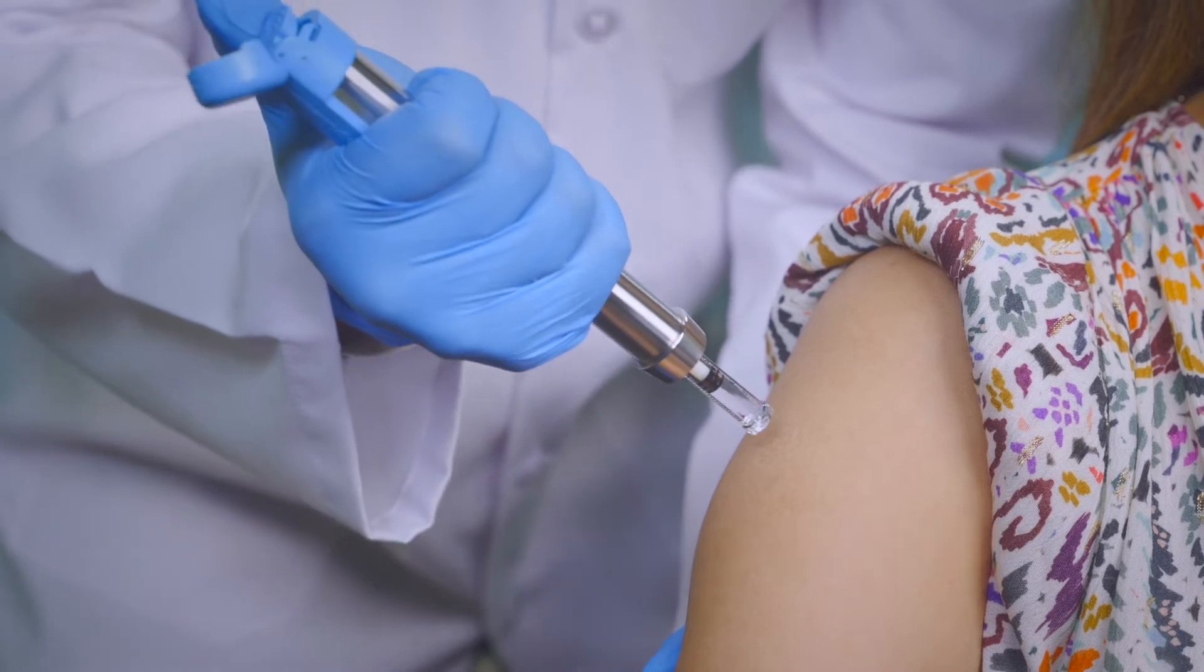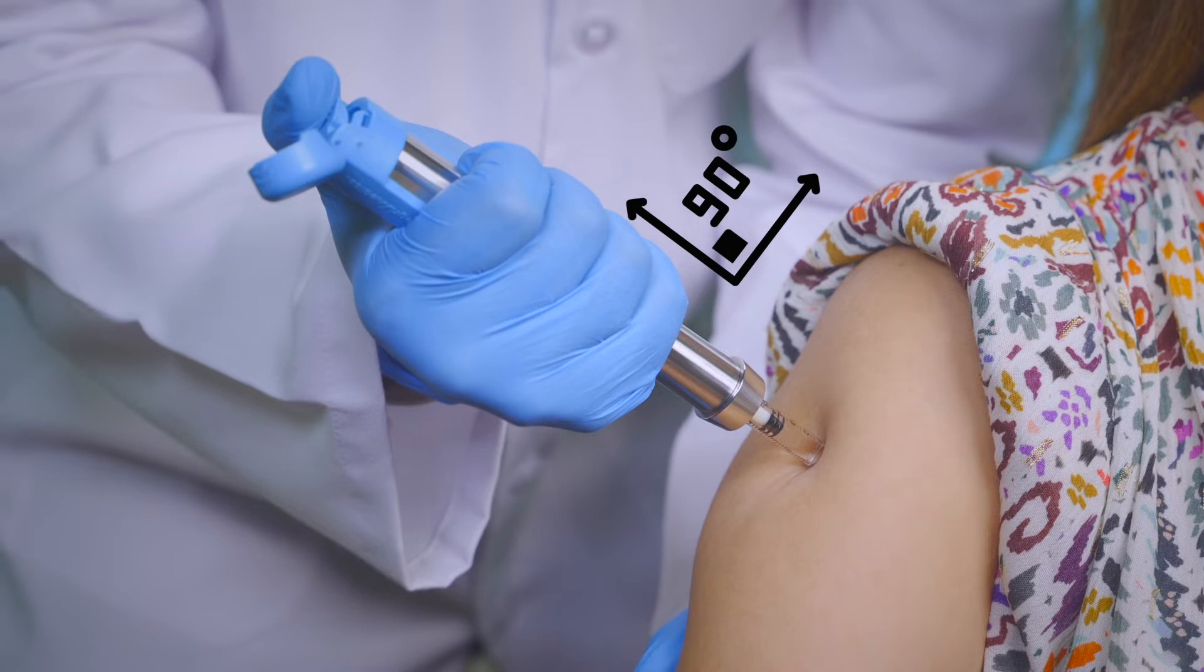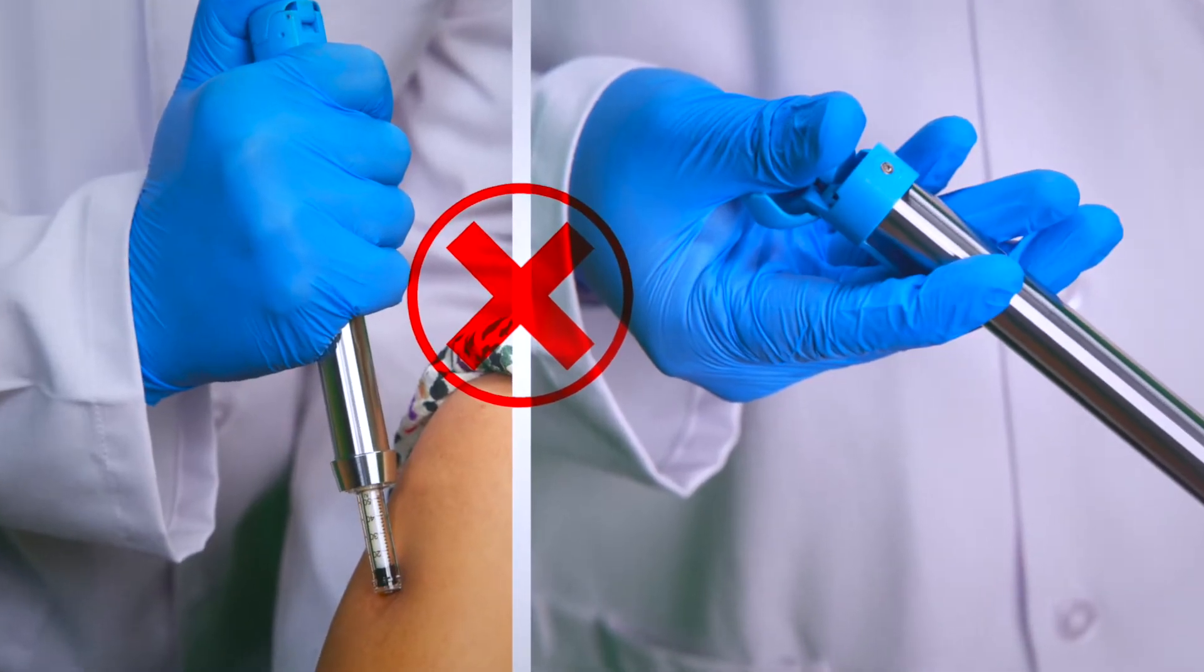It is important to position the NFIS device at a 90-degree angle to the injection site. Do not hold it at any other angle to avoid spillage.